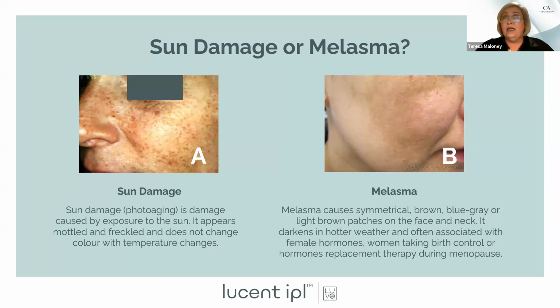I want to disrupt it so that the body comes in and I get that collagen stimulation to help exfoliate and remove some of it. You can improve melasma anywhere from 10% to 95% in one treatment, but everyone's melasma is their own and it's unpredictable how much improvement you're going to get with one treatment, but all you can do is try. The thing that we would never recommend is to continue going back and hitting it with IPL. What you want to do is treat it, see how much you resolve of it, and then move them on to other technologies for further improvement.